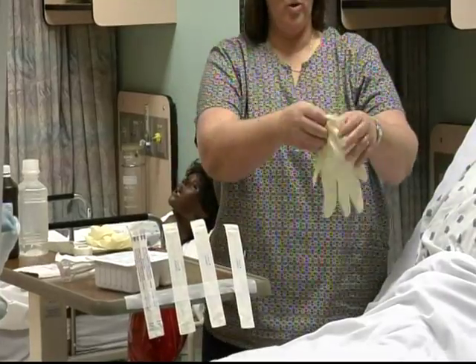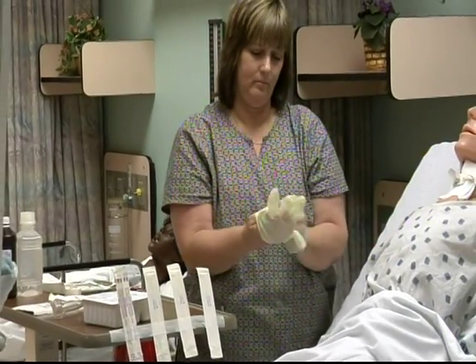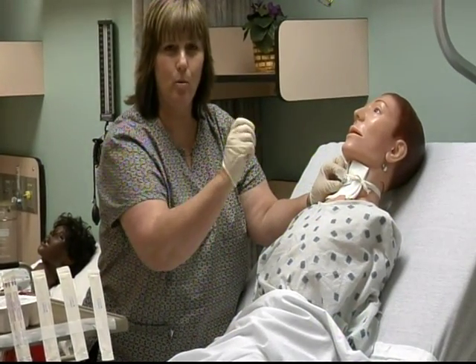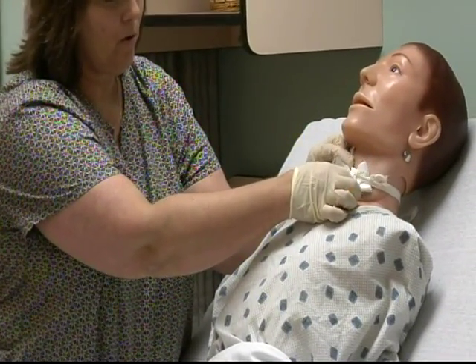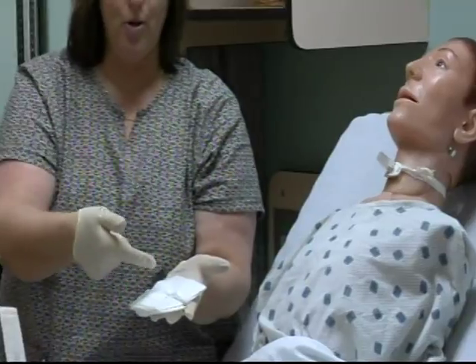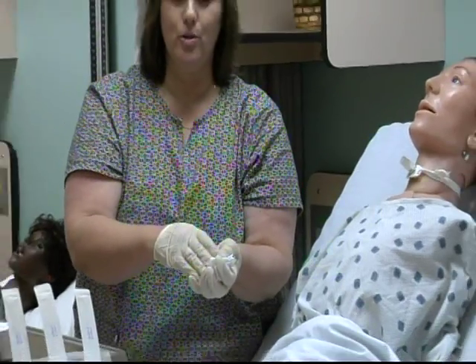Now, place on your clean gloves to remove your old dressing. While you're removing your old dressing, make sure you hold this trach, because you don't want it to irritate the patient. So gently just remove the old dressing while you're holding the trach. When you remove the old dressing, turn it upside down so you can actually look at the drainage, see what color it is, whether there is any foul odor, and then you need to document this in your nurse's notes.